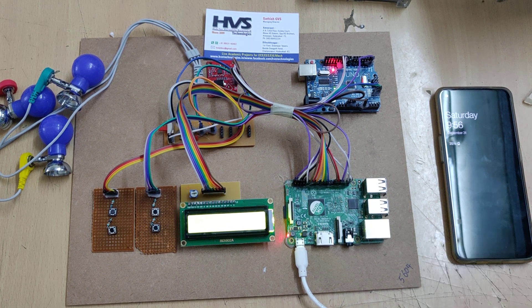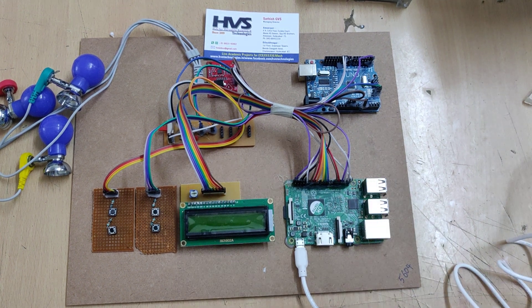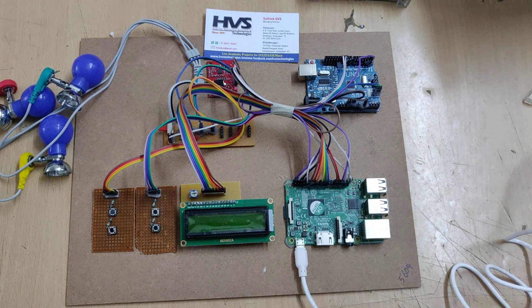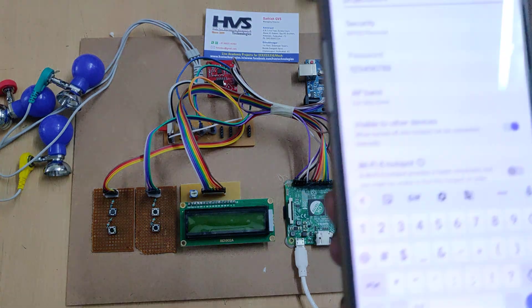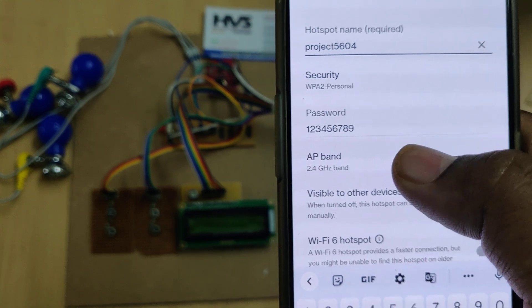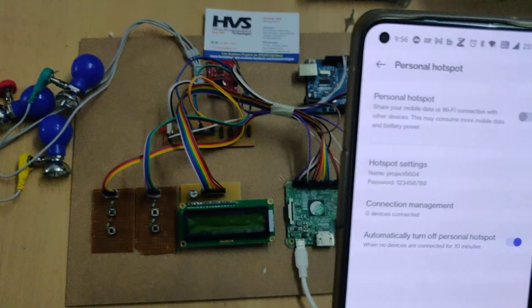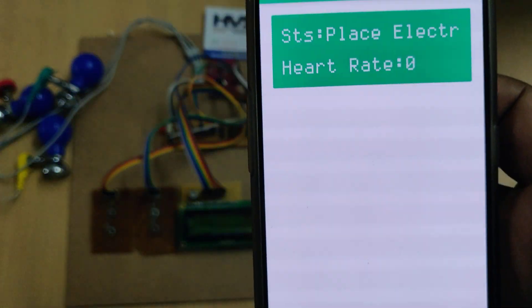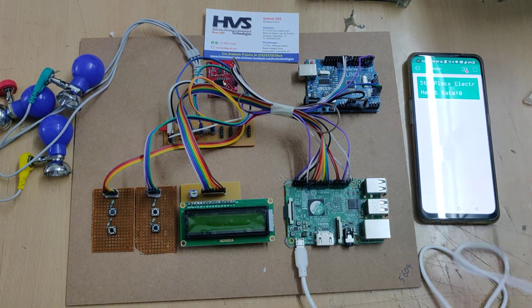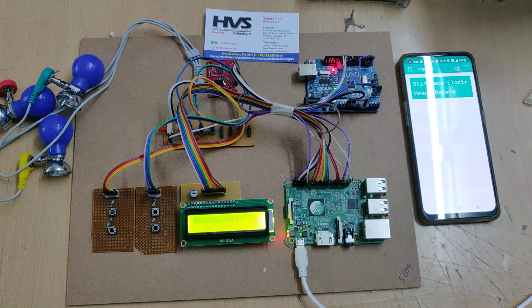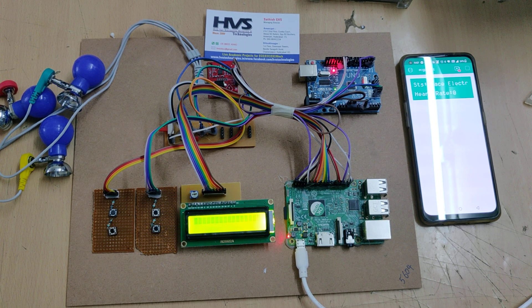Before switching on the system, enable the hotspot on your phone — the system uses it to send data to the Blynk application. Set the hotspot name to '5604', password to '123456789', and the AP band to 2.4 GHz, then turn on hotspot and mobile data. After that, log in to the Blynk application. Once you switch on the kit, the system automatically connects and a welcome message is displayed on the LCD screen. This process takes a maximum of 20 to 30 seconds.